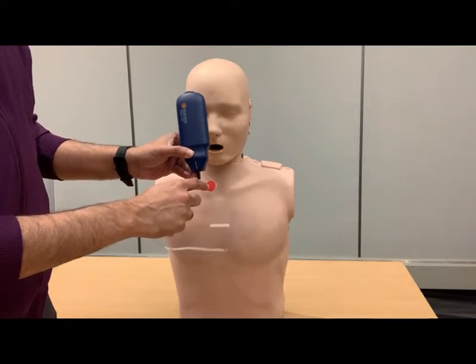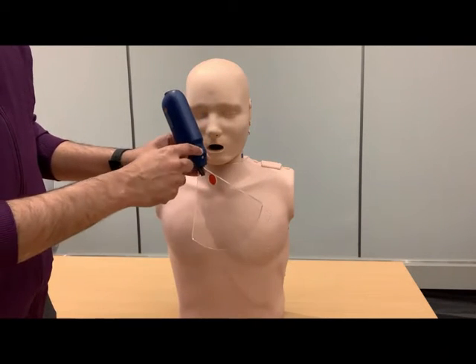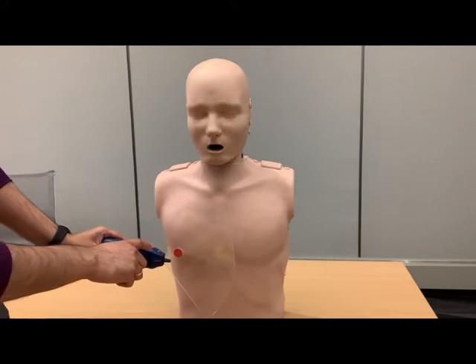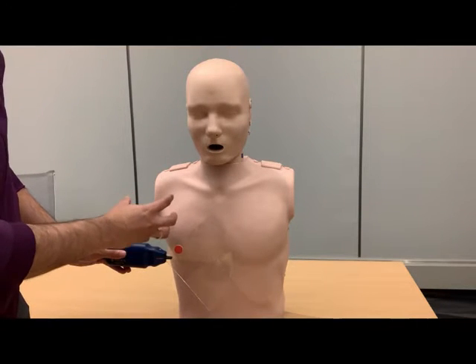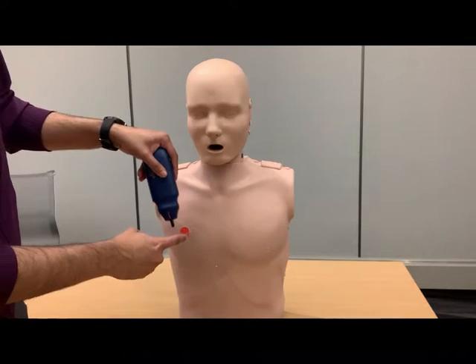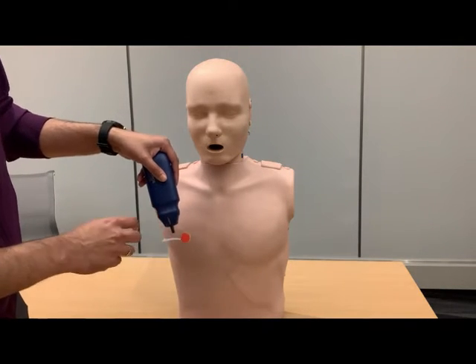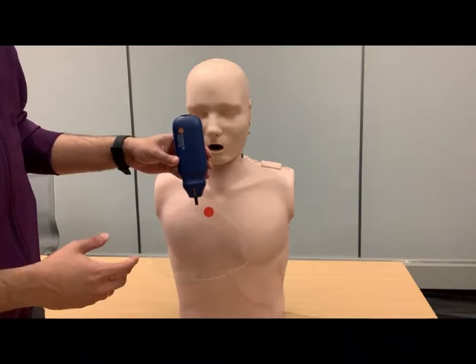Here you have the screen orientation marker, which you can call the screen indicator. Both these things always correspond to each other. For example, if I'm obtaining the image of the kidney with the orientation marker of the probe towards the patient's head, the part of the kidney that is towards the patient's head — that is the upper pole of the kidney — is depicted on the portion of the screen towards the probe orientation marker. So the upper pole of the kidney will be here and the lower pole of the kidney will be here.